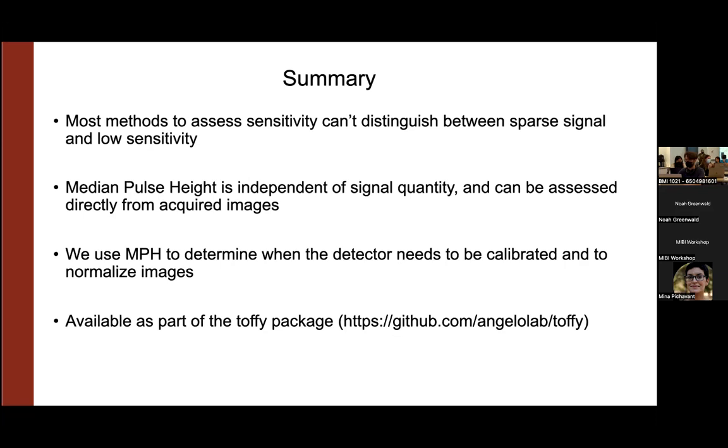Currently, no. I think it hasn't come up yet for us. I think probably for you guys, it won't come up since all of your tissues are perfectly preserved. Yeah, but in other circumstances where maybe clinical samples are not preserved immediately, or maybe there's some kind of lag time. There's been work to try to look at this. David Rimm's lab at Yale actually did some work about 10 years ago, looking to see if you could identify bellwether housekeeping proteins to assess tissue preservation.